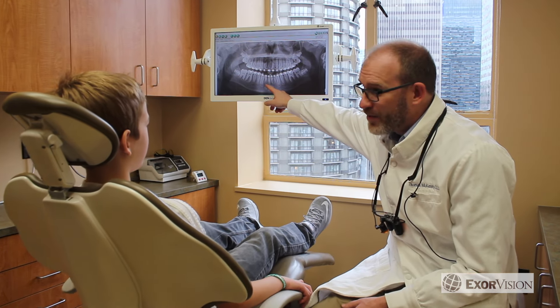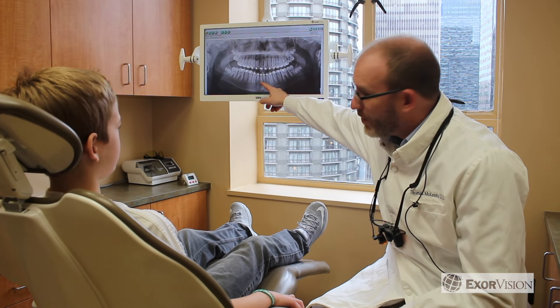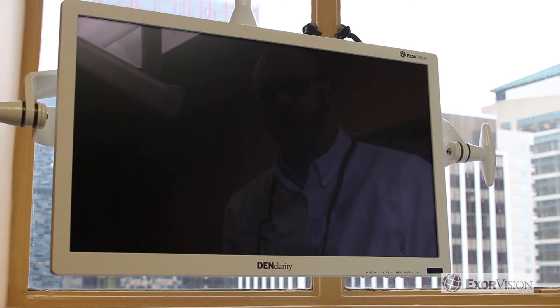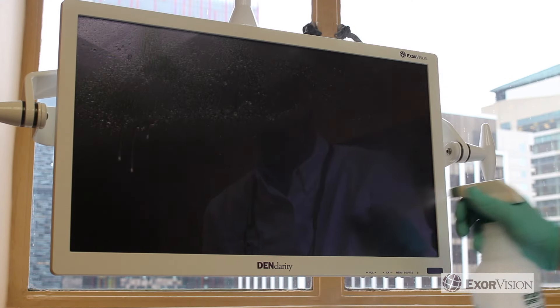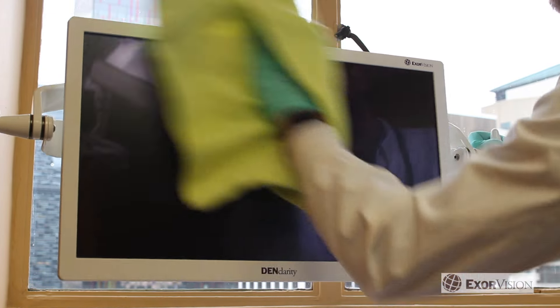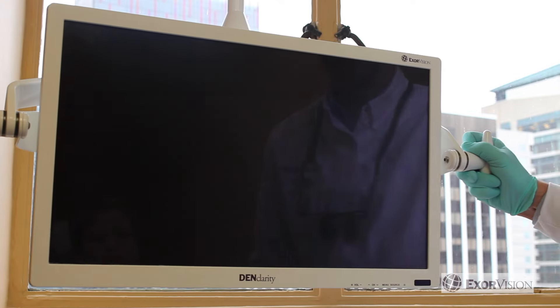ExorVision's DenClarity Dental Monitors can help you and your practice be more professional. Unlike other consumer grade monitors, our dental grade monitors are water sealed, which means you can use liquid disinfectant on the entire screen, so it won't get water damage and it's more hygienic.